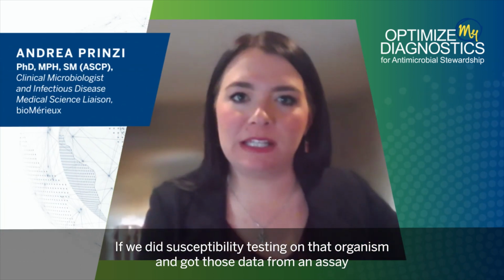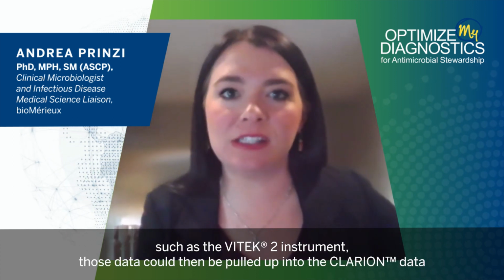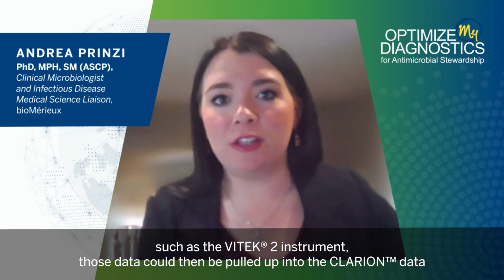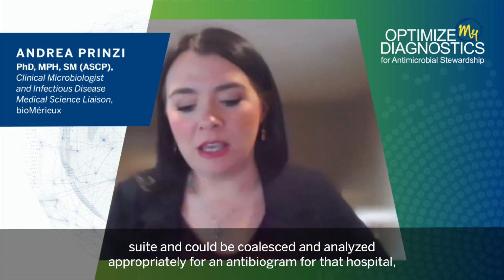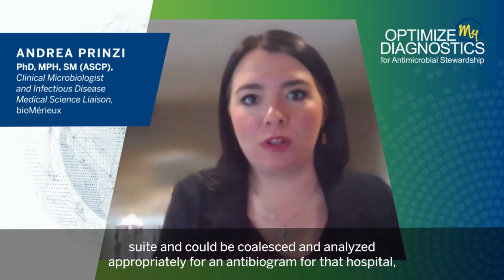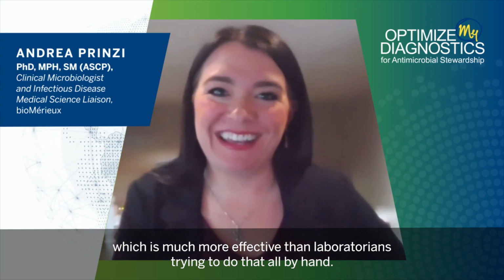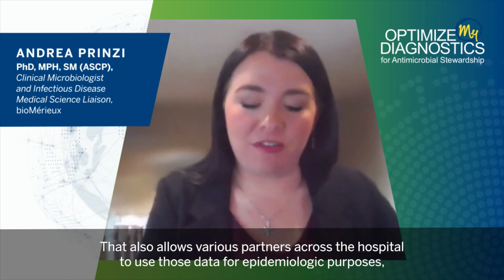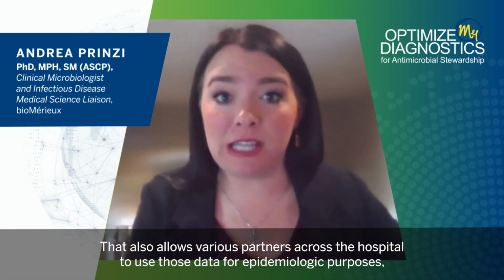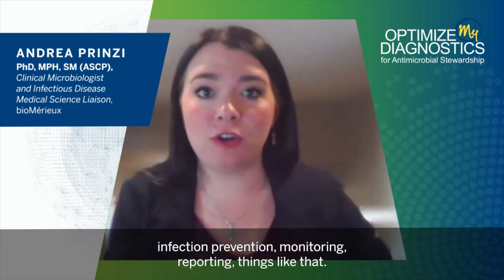If we did susceptibility testing on that organism and got those data from an assay such as the Vitek 2 instrument, those data could then be pulled up into the Clarion data suite and could be coalesced and analyzed appropriately for an antibiogram for that hospital, which is much more effective than laboratorians trying to do that all by hand. That also allows various partners across the hospital to use those data for epidemiologic purposes, infection prevention, monitoring, reporting, things like that.